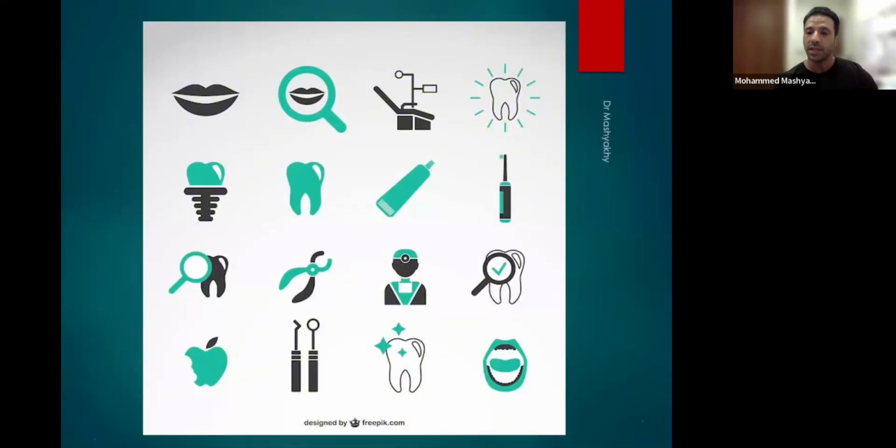But in root canal treatment, unfortunately, you tell the student, okay, curve the file, put it, find the mesiobuccal canal, then put another file and put it in the MB2, then bypass the curve. And the student, without a loupe, just goes with a big smile on his face and doesn't know what you are saying exactly. He just puts the file in the canal. He doesn't know where the file goes. Then he goes home, and says, I hate endo. I'm not going to do endo at all in my life.